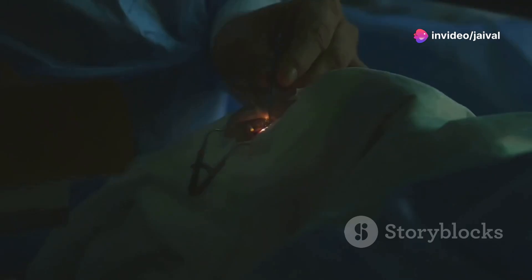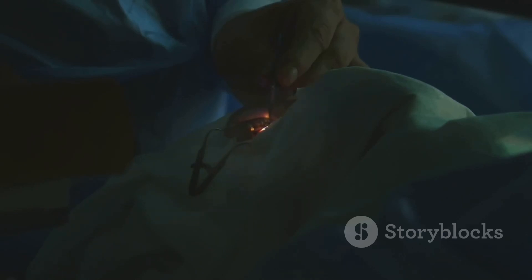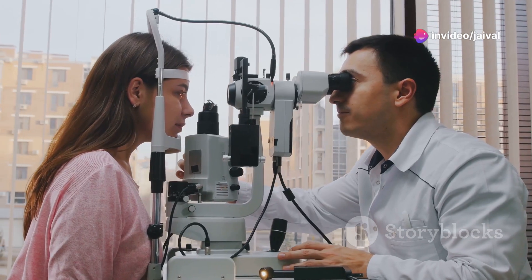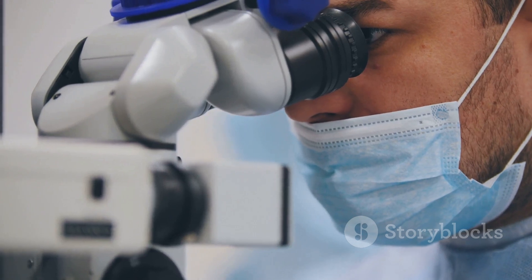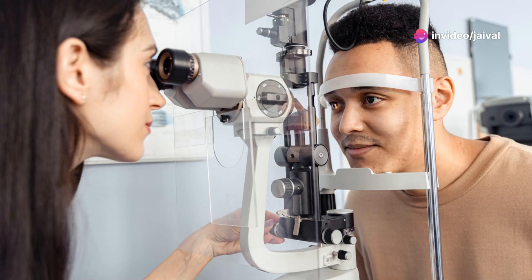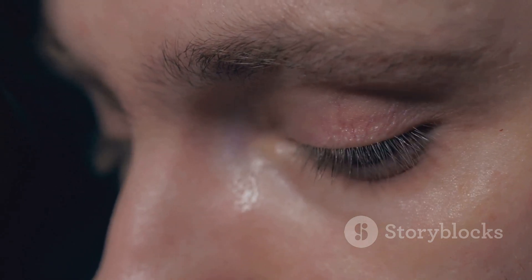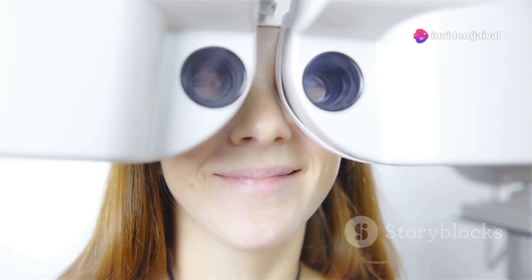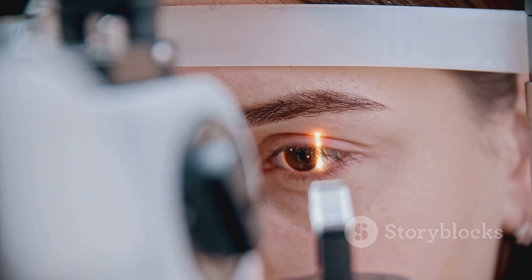With the patient positioned comfortably and the eye thoroughly anesthetized, begin by gently retracting the upper eyelid. Instruct the patient to look upwards — this upward gaze provides better access to the eye and helps in stabilizing it, making the procedure smoother and more efficient. Approach the eye with the goniolens held perpendicular to the cornea, ensuring your hand is steady to avoid sudden movements. Gently place the lens on the inferior cornea, taking care to avoid applying pressure on the limbal area. This delicate placement is vital to prevent any potential damage to the eye.